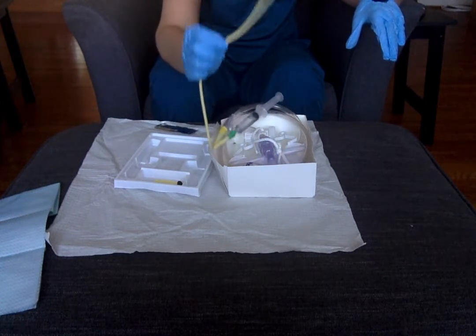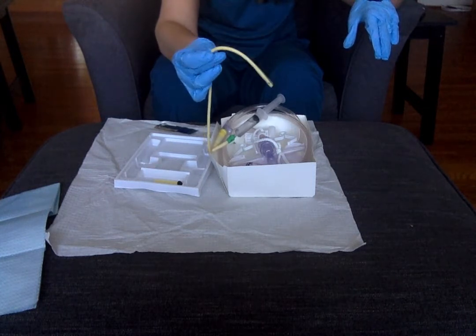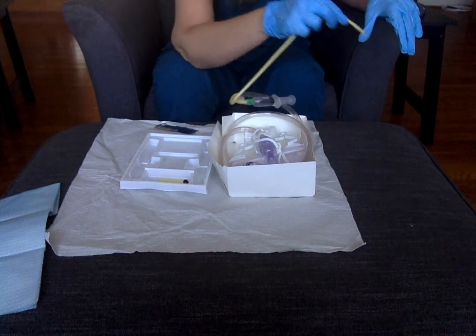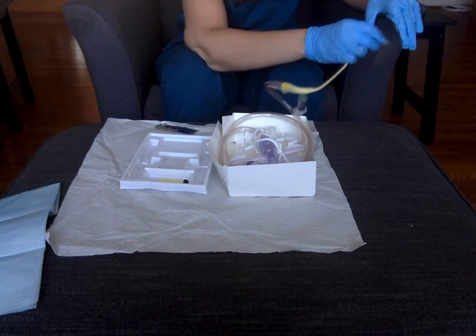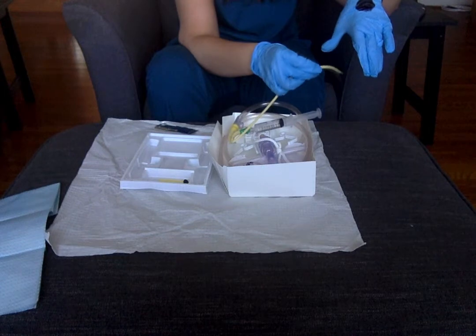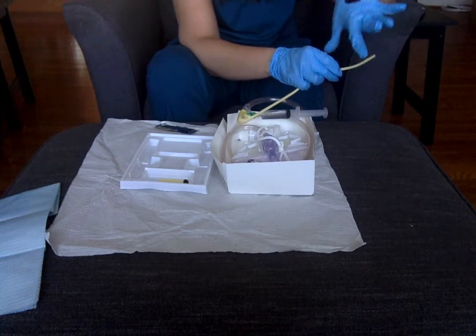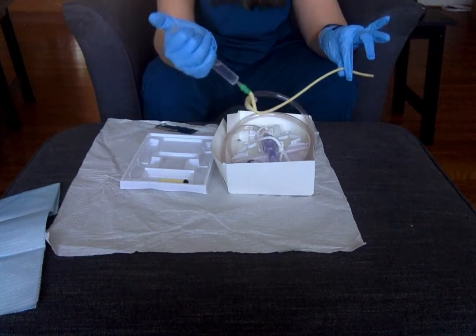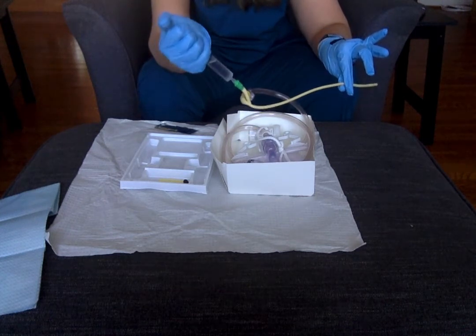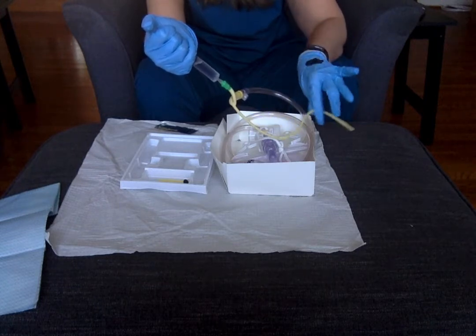Now I'm ready to insert. I've got my catheter — you want to hold it about two inches from the end so you have good control. If you hold too far away, you won't be able to control it to get it into the urethral meatus. I'm going to dip it in my lube and then go ahead and insert it directly in, keep sliding it in. This hand here can never bump into the tissue — it has to stay away so it stays sterile, so you kind of feed the catheter in. Once I see urine, I'm going to push it in two more inches, then let go, stabilize with this hand, and then inflate the balloon. You would inflate your balloon — all 10 milliliters — then gently tug this down to make sure it's seated at the base of the bladder. Then you can let go because it's inside.